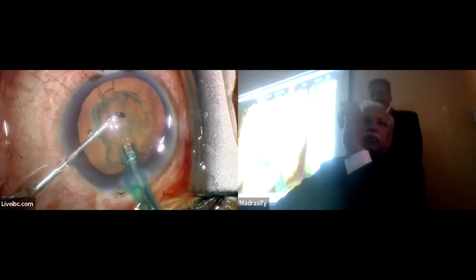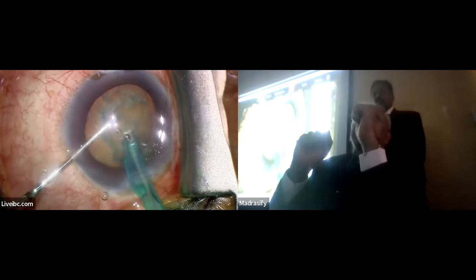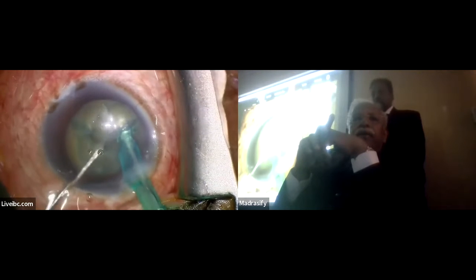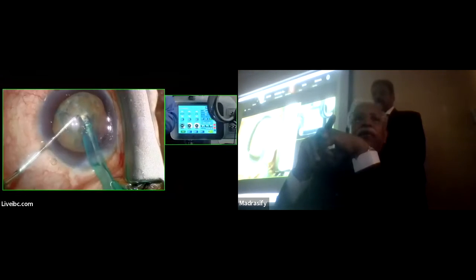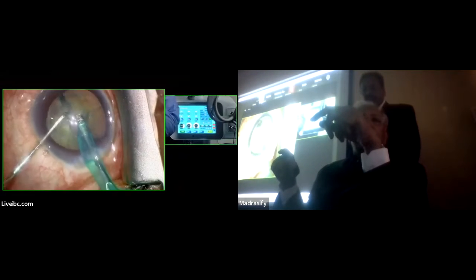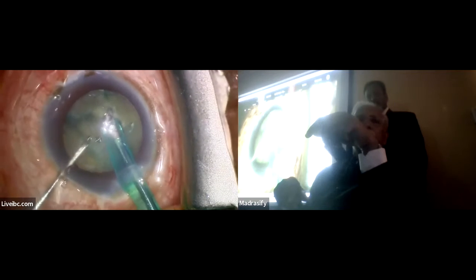Making a punch at the positional area. What microscope is this? Zeiss. Zeiss RTO 800. We are going to plan with this Zeiss. This is for cataract.